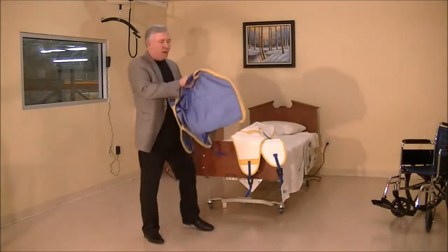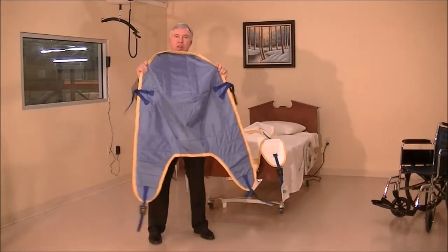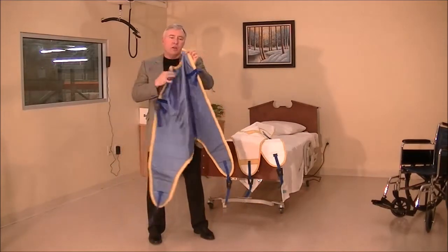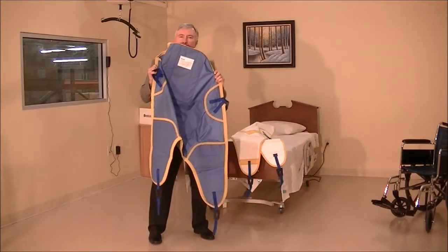but I wanted to show you how we have both a washable clip sling, which you can see is in the blue material. You toss it in the laundry, clean it up if you need to reuse it.